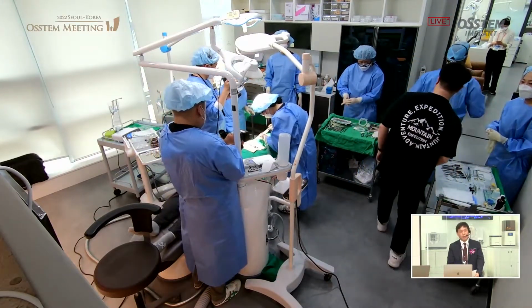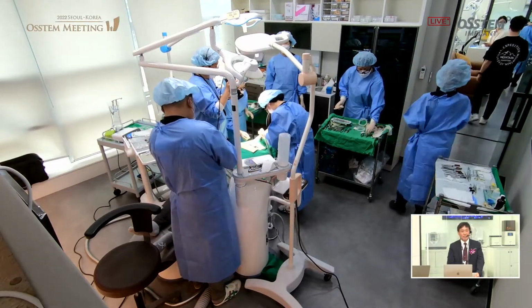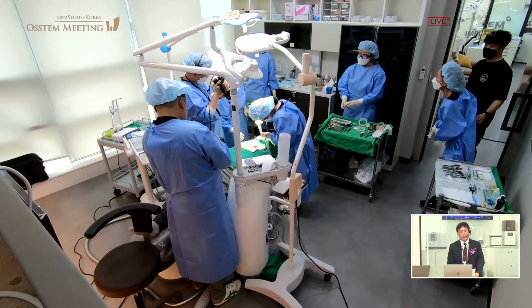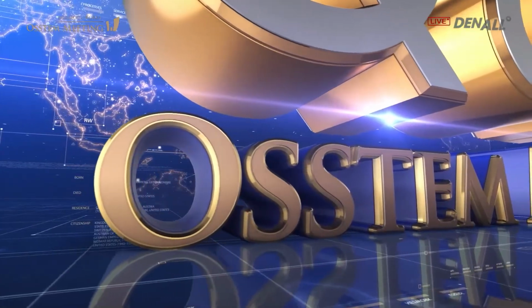So live surgery progressed very well, and we will have Q&A with Dr. Chung and the patient. Post-op facial panorama will be taken.